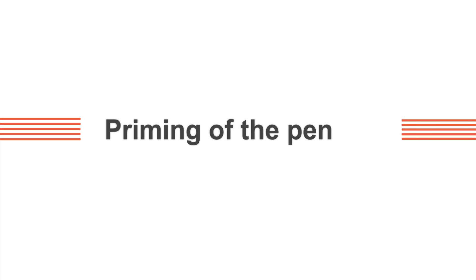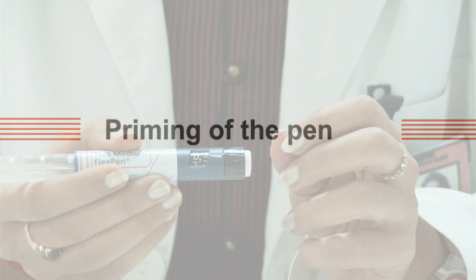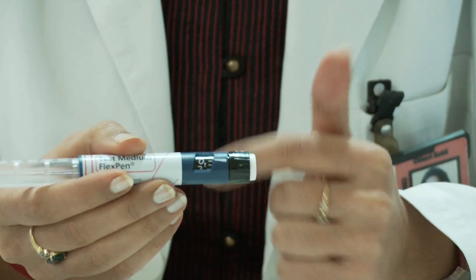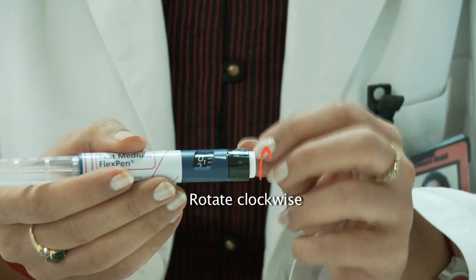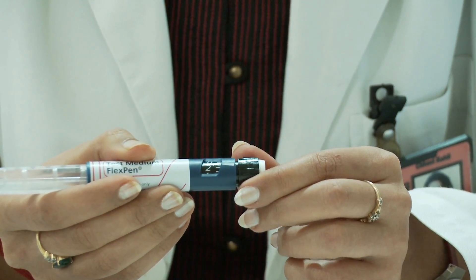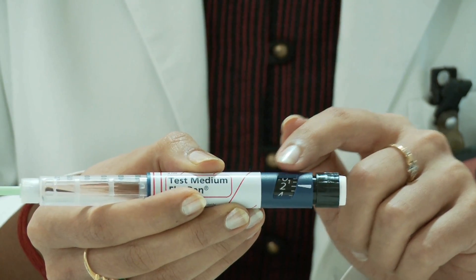Priming of the pen. Priming the pen is important before we start using the pen. For priming it, set the dose to two units by rotating the dose dialer in the clockwise direction. Make sure that the dose is in a straight line with the white arrow.